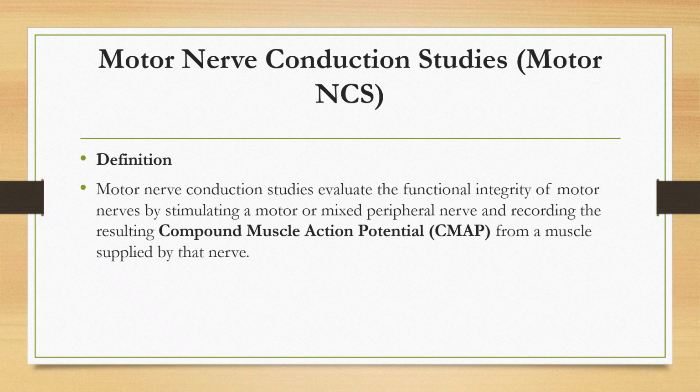Motor Nerve Conduction Study. Motor nerve conduction studies evaluate the functional integrity of motor nerve by stimulating a motor or a mixed nerve and recording the resulting compound muscle action potential from the muscle supplied by that nerve.